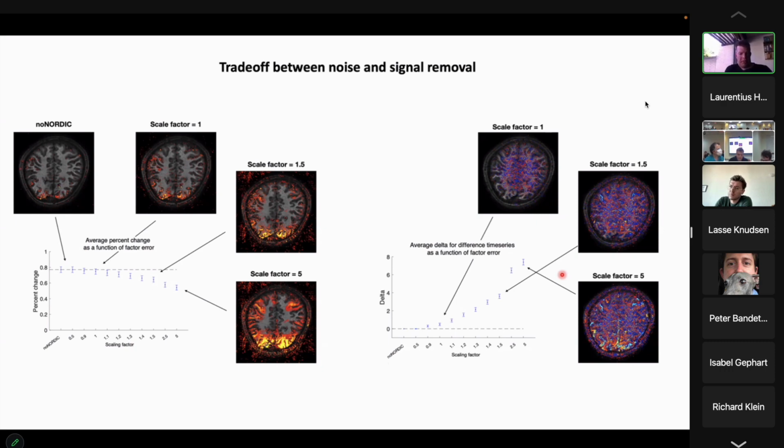It could, however, be an enormous amount of benefits anyway. I would like to see this particular figure with a constant number of super threshold voxels, because that's, I think, a good way to demonstrate whether you use the increased sensitivity to also increase the specificity, or whether you could just turn up and down the threshold instead.